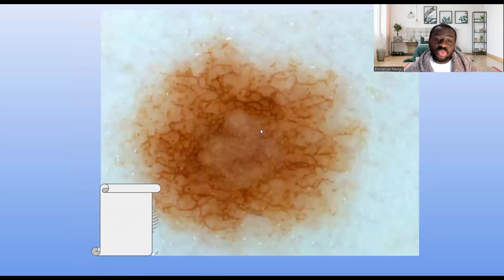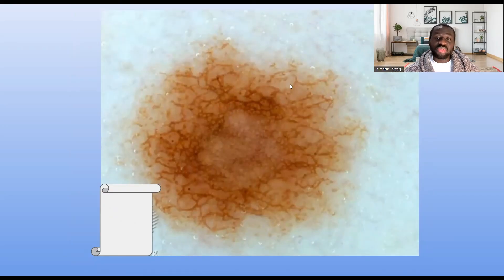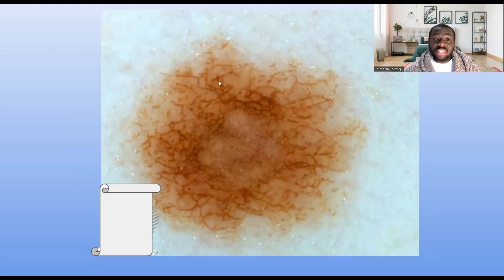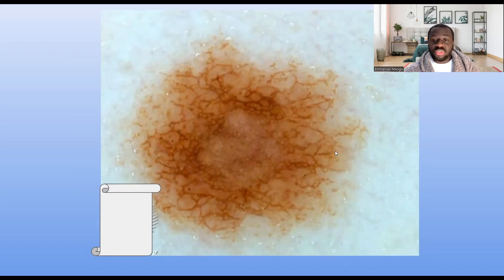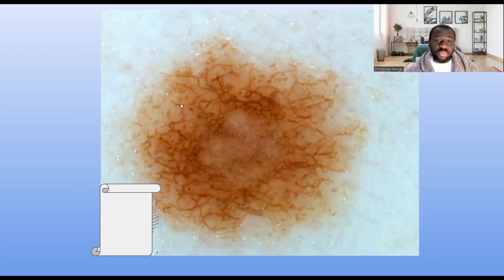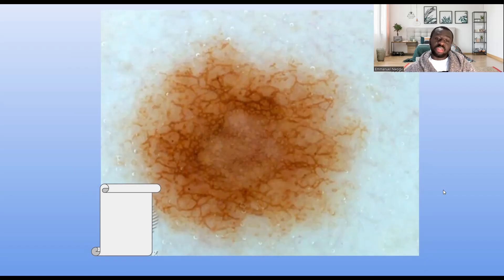This lesion has two, even three levels of pigmentation, but the most important thing is that it is symmetrical. You ask yourself: what is the symmetry, what is the pigmentation, the regularity, and if it has a reticular network, is it uniform? If you look at the net-like structures, they appear uniform. Dividing this lesion horizontally or vertically gives fairly two equal halves. There is a different level of reticulation in the central area, but overall it looks uniform — a uniform reticular network. This is a benign melanocytic nevus.